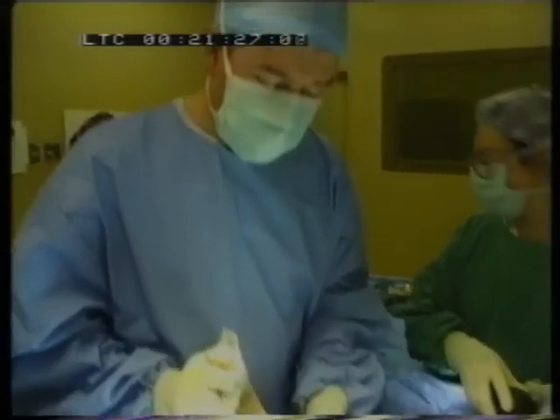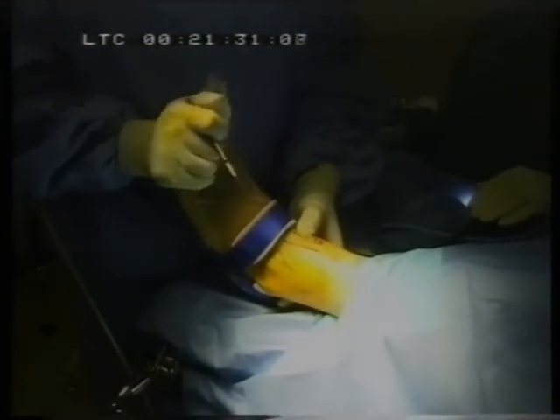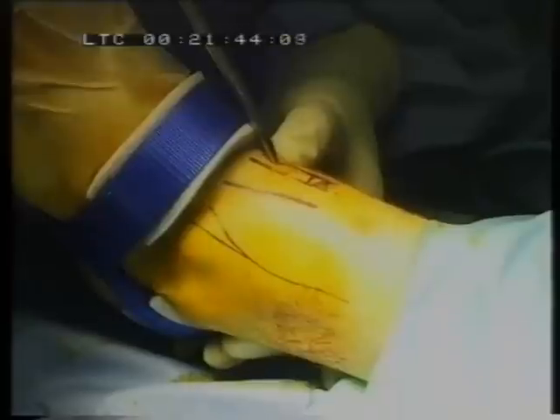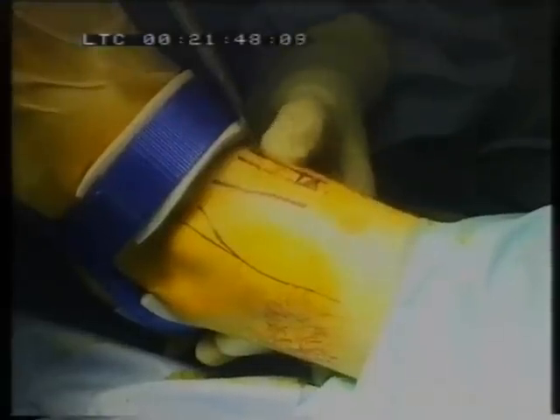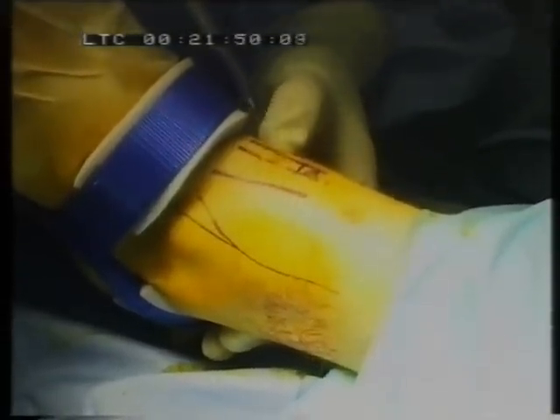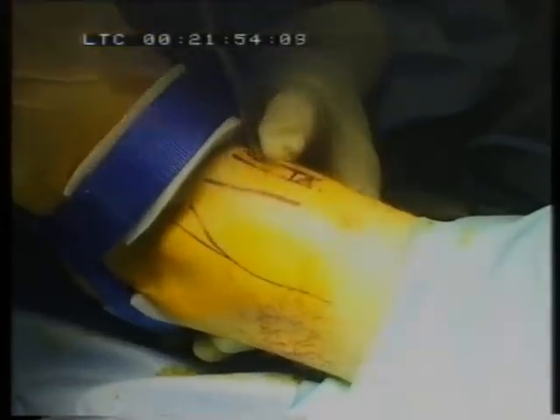In order to place your portals, I first move the ankle up and down so I can easily identify where the talotibial joint is. An incision is made which is approximately eight millimeters long, and I tend to place it close to the tibialis anterior so that I can avoid the saphenous structures, as I know they won't be close to the tibialis anterior. You can even sometimes roll the saphenous nerve over your thumb — in this gentleman, because he's relatively thin, I can flick it backwards and forwards.